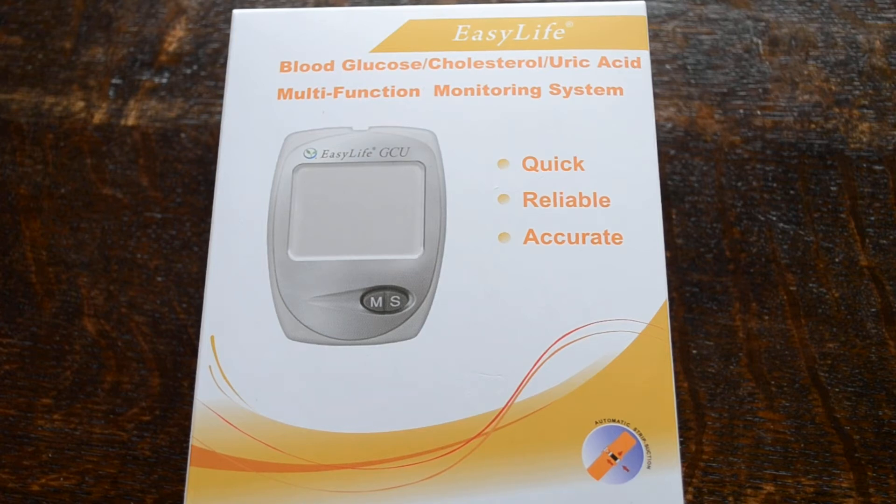Welcome to this video presentation. We're going to demonstrate for you the EasyLife blood glucose, cholesterol and uric acid meter.